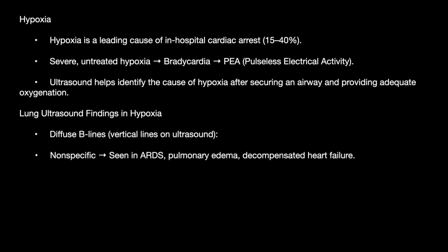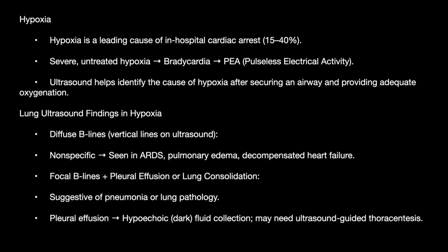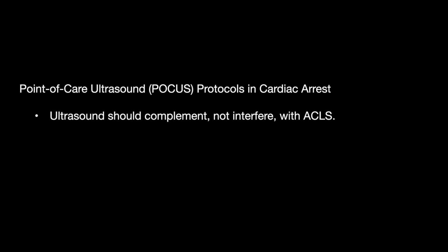The findings that we can find are diffuse B lines, non-specifically seen in ARDS and pulmonary edema; focal B lines or pleural effusion, which is a hypoechoic collection; or lung consolidation, such as in pneumonia, which is a tissue-like lung appearance. So what are the various protocols?